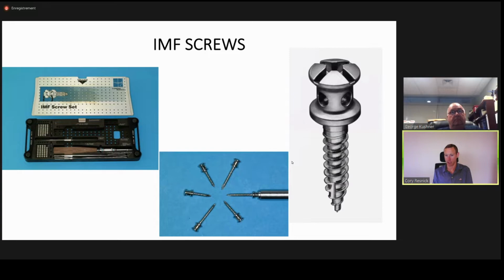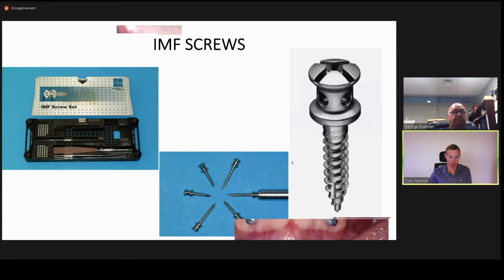So they're not quite as perfect for complex fractures, comminuted fractures, fractures in multiple dentate segments. But for simple fractures, particularly ones where intermaxillary fixation is really only needed during the intraoperative components of the procedure and guiding elastics are not going to be necessary postoperatively, or postoperative maxillomandibular fixation is not planned, IMF screws can really be a quick way to provide the necessary occlusal relationships.